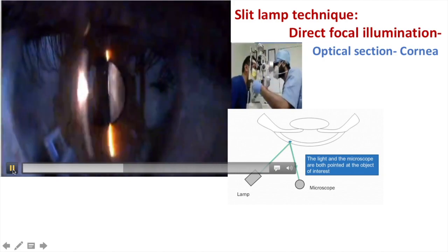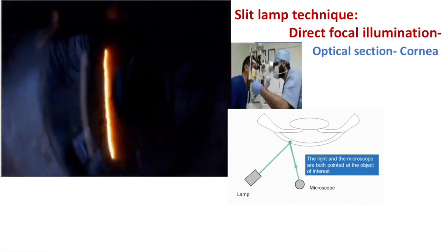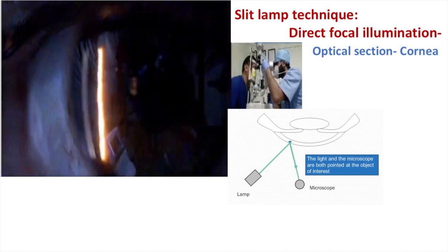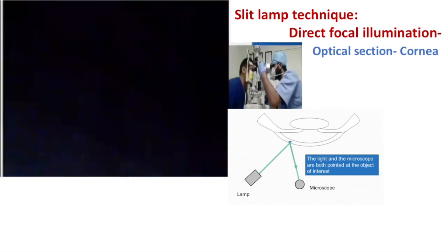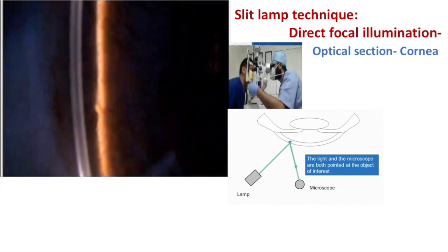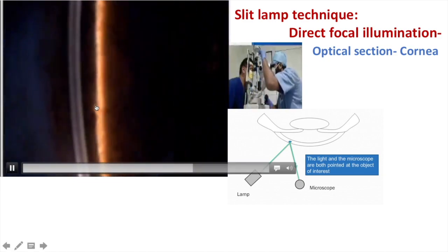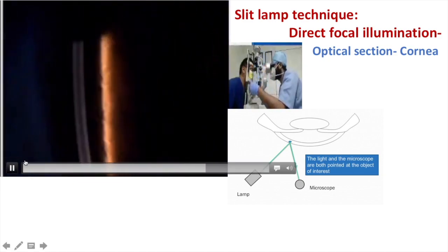I will take the slit to the periphery because the periphery of the cornea is thicker and it's easier to appreciate the layers. I'm magnifying the slit and increasing the illumination, and now we can appreciate the various layers of the cornea. This is the optical section of the cornea. The reflection you see is from the iris — our focus is right here, which is direct focal illumination.